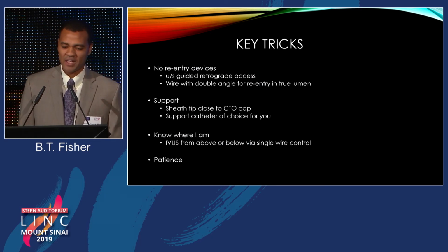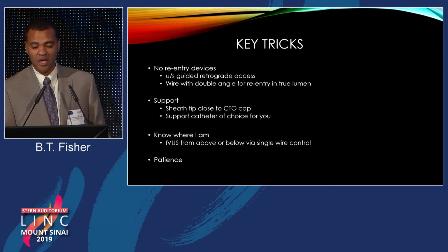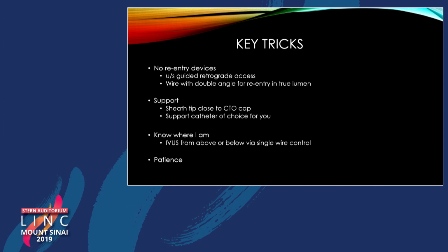And then just finally, some of the key tricks. Again, no reentry devices. I just don't use them, don't need them. Ultrasound guided retrograde access really takes care of that. And then getting the wire to double over.